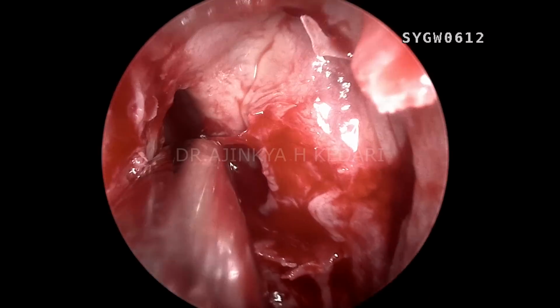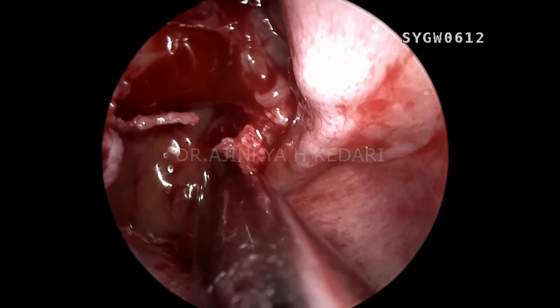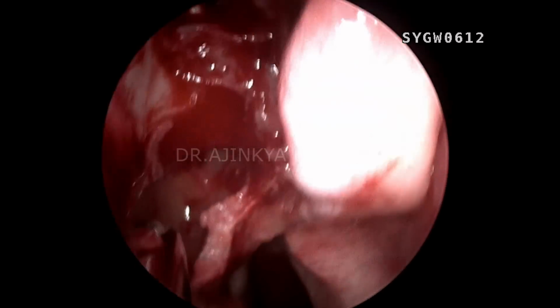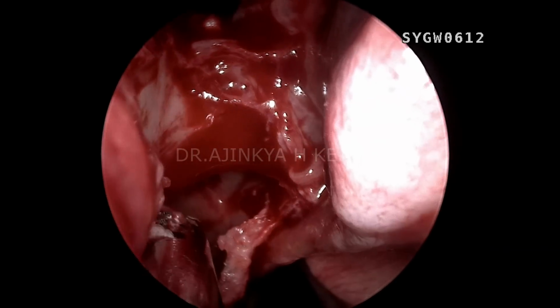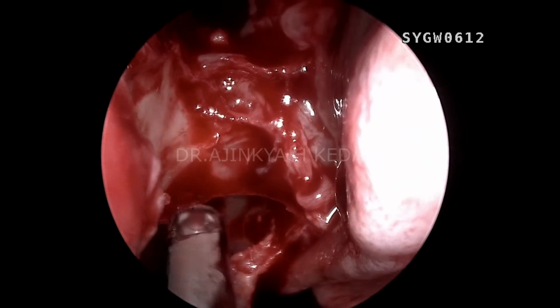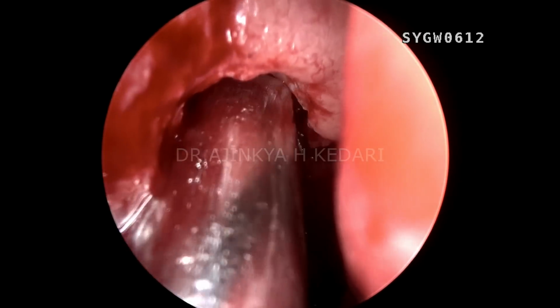You can see I'm just debriding all that cellular area of the anterior and the posterior ethmoids. That's the posterior ethmoids where my debrider was, where the second site of the leak is basically. You can see that's the posterior most attachment of the middle turbinate, which is definitely in the posterior ethmoidal area. So you can see the amount of visualization we have achieved just by performing a FESS procedure on the patient's right side. That's the entire lamina papyracea exposed superior to inferior.